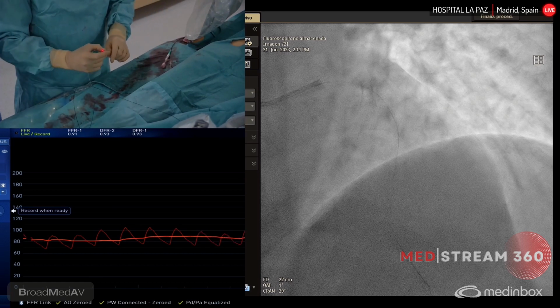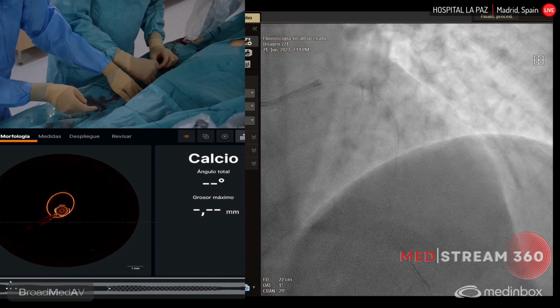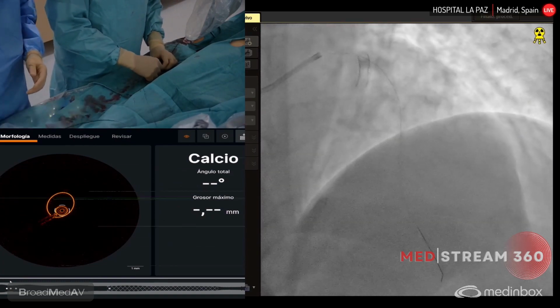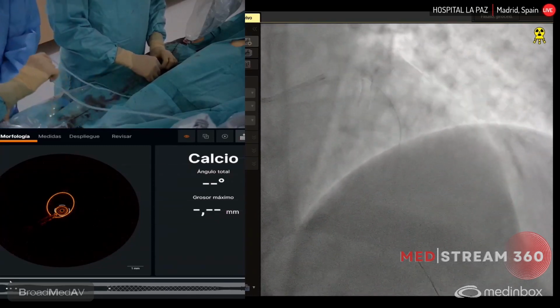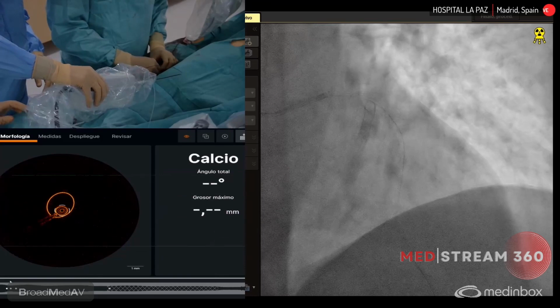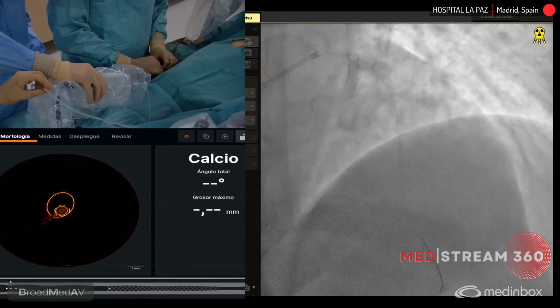Danny. Another question. How distal do you place the catheter for FFR? Yes, it's a good question. I think just distal to the lesion is enough. Probably in this case we have gone much more distally, but it's negative even there. So we are sure that the result is negative. If you think that there is some distal disease, or this is a focal lesion, we could go more distal, but I think it is not necessary in this case. We only want to analyze the focal lesion of the mid-LAD.